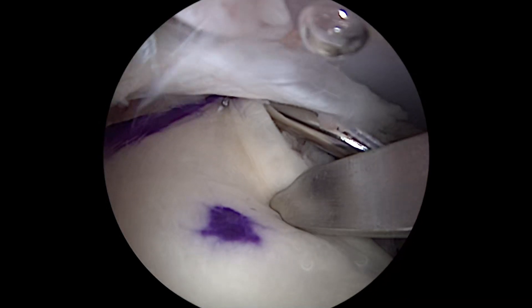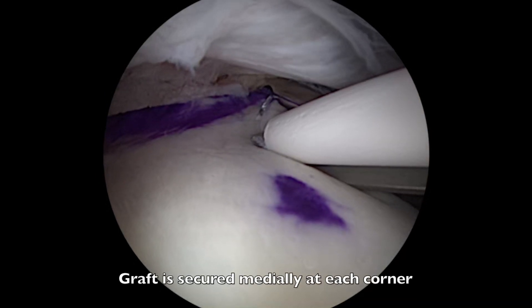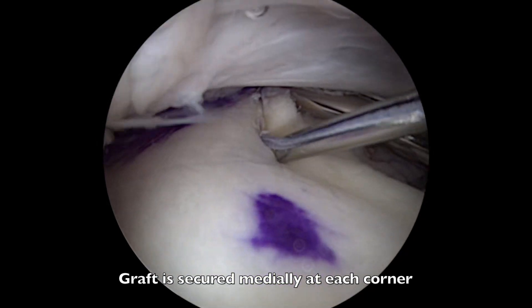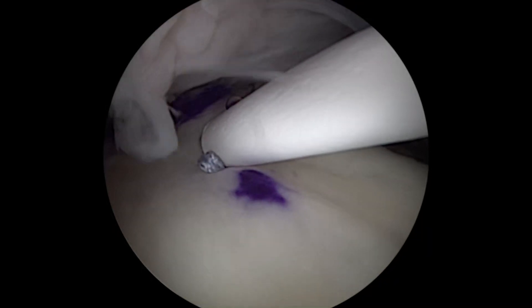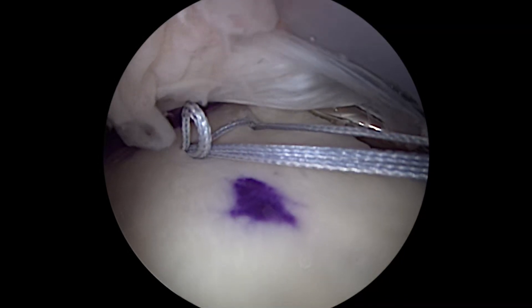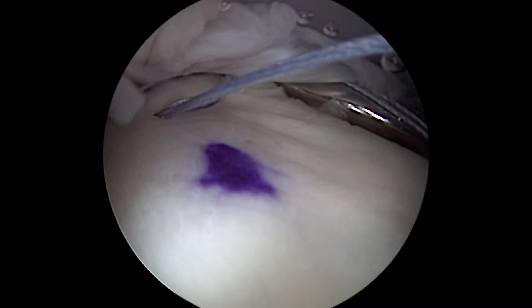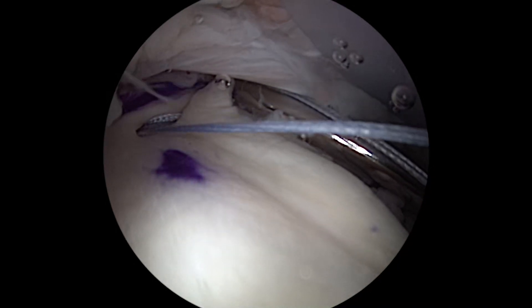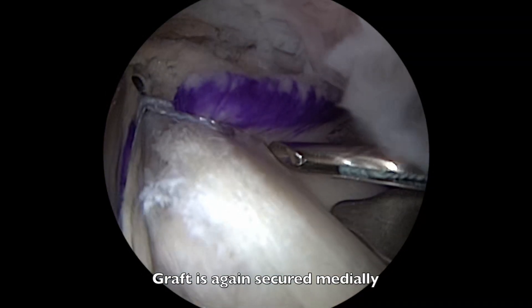The graft can now be secured medially at each corner with these all-suture repair devices. This is then repeated at the posterior medial corner of the graft.